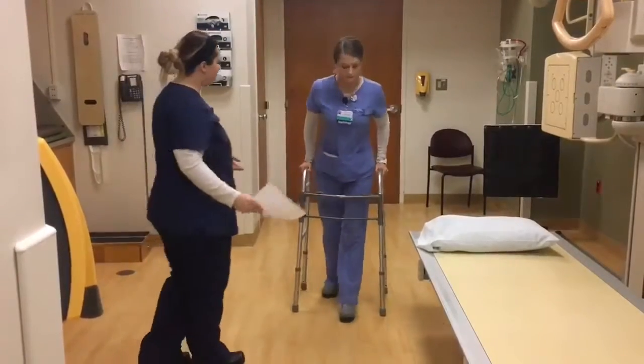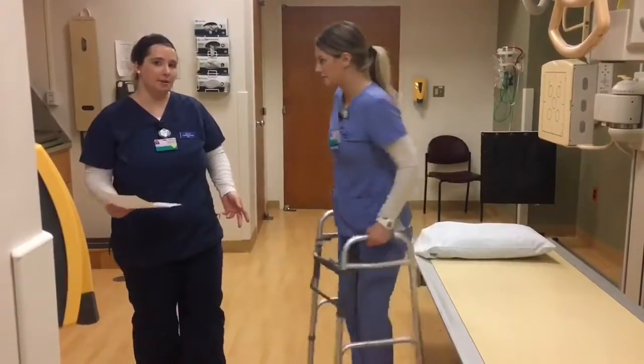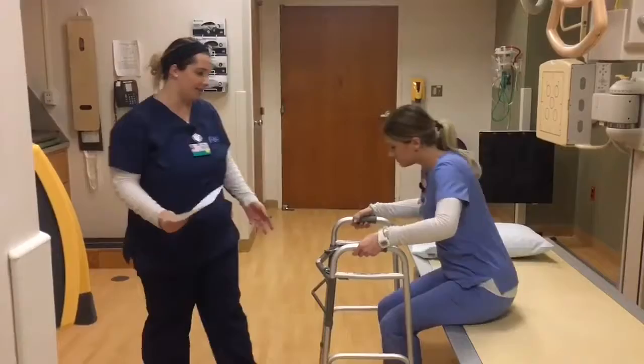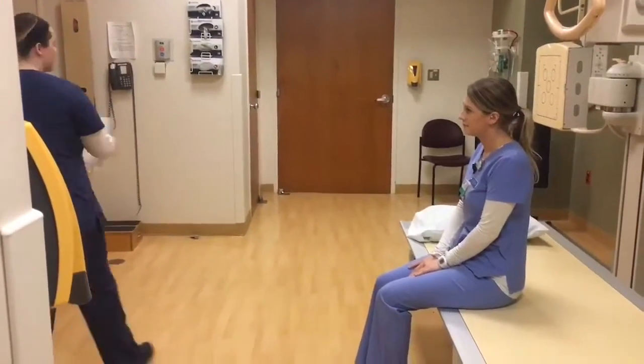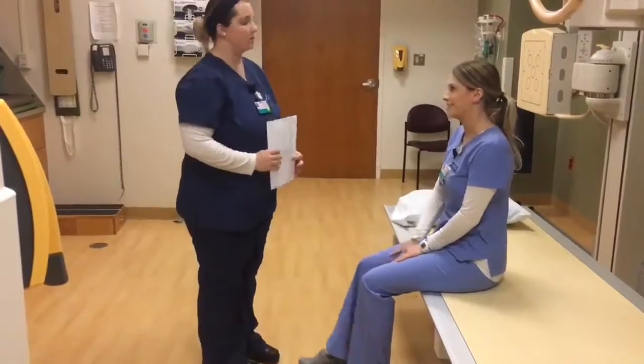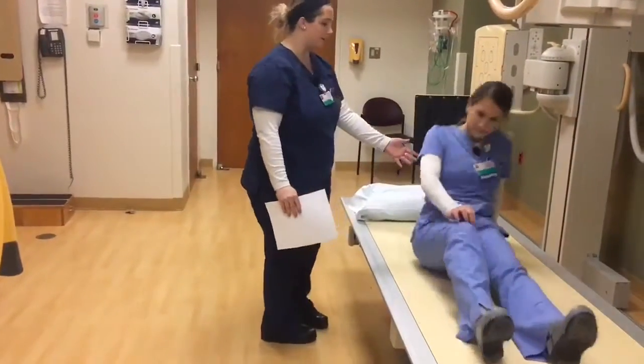Shannon, I'm going to have you take a seat right on my x-ray table. I've already confirmed my patient's name, date of birth, and if there was any chance of pregnancy. Shannon, what leg has been bothering you? My right leg. Okay, I'm going to have you lean back. You can lay your head right back.